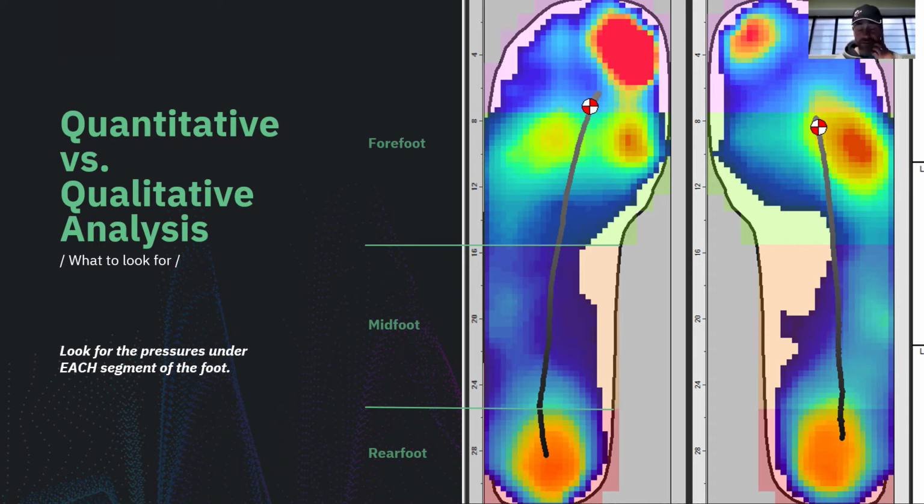As we have seen in our previous episodes of this sports performance science series, one of the main features of a plantar pressure measurement technology is the ability to differentiate and isolate the foot, and due to the matrix configuration of the measurement technology, the possibility to divide and create segments of the foot and regions of interest. In this case, we are looking at rear foot, midfoot, and forefoot.